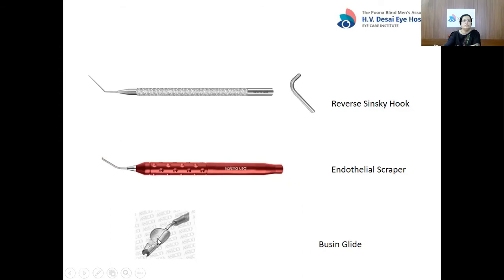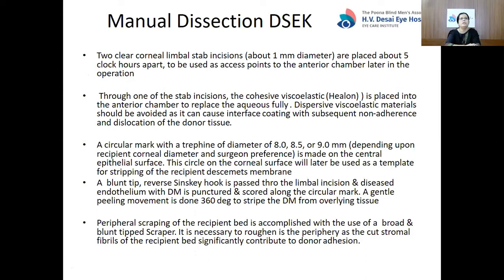Coming to a step-by-step description of the surgery — manual dissection DSAEK. Two clear corneal limbal stab incisions are placed about 5 clock-hours apart to be used as access points to the anterior chamber. Through one stab incision, a cohesive viscoelastic is placed into the anterior chamber to replace the aqueous fully. Dispersive viscoelastics should be avoided as they can cause interface coating with subsequent non-adherence and dislocation of the donor tissue. A circular mark with a trephine of diameter 8, 8.5, or 9 mm — depending on recipient corneal diameter and surgeon preference — is made on the central epithelial surface. This circular mark will serve as a template for stripping of the recipient Descemet's membrane.